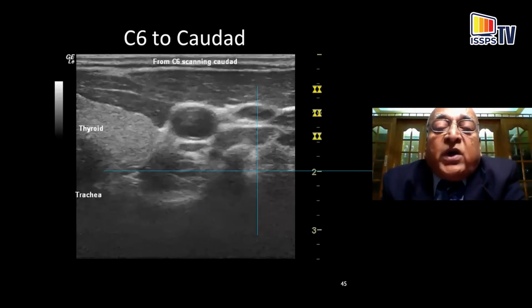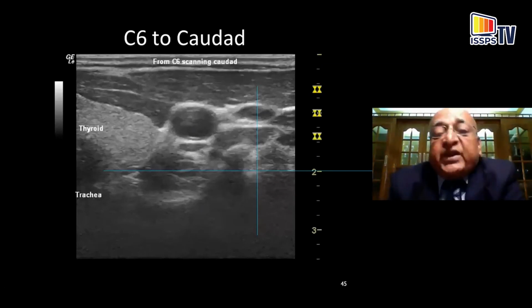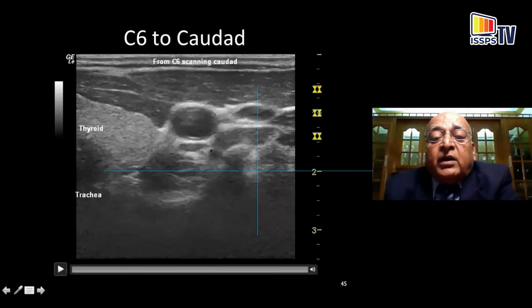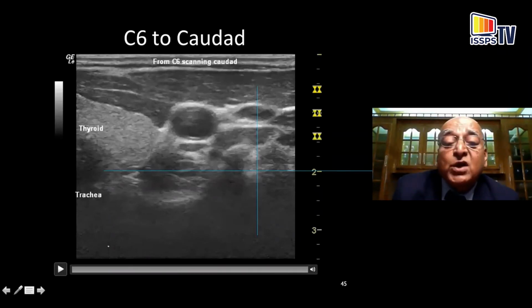Now, the reason why you want to do that is much more specific for the sympathetic innervation of your upper extremity. We all know that the cervical sympathetic chain travels just beneath the prevertebral fascia located on the longus colli muscle. And here you can see the inferior thyroid artery right there. So if I were to plan on injecting here, it will be very difficult. You can see the longus capitis here.